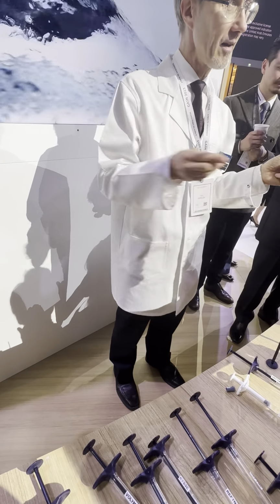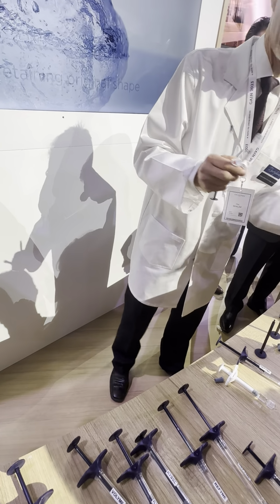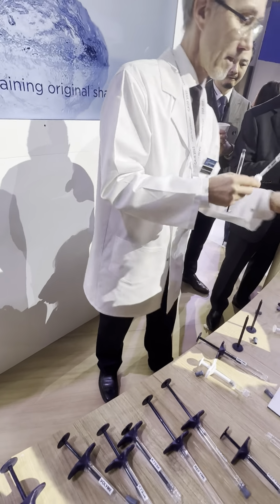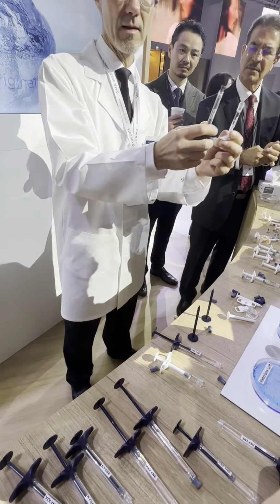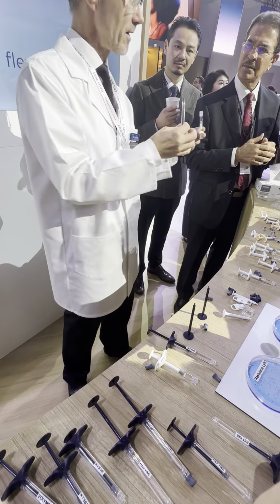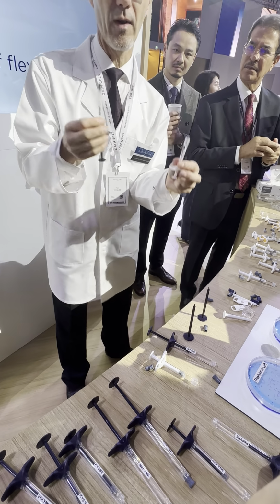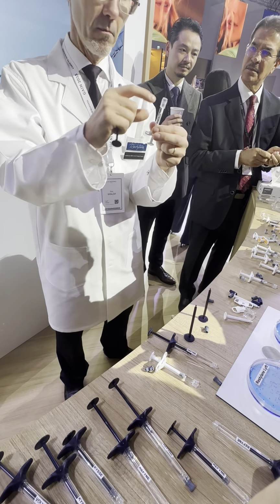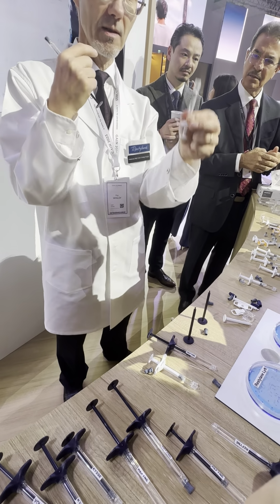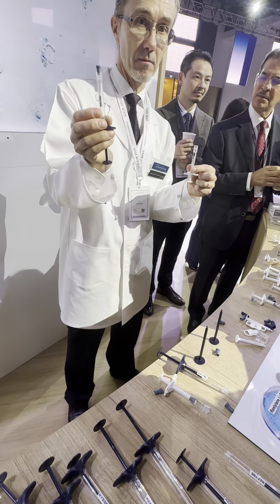This product is actually the same as Restylane Classic. A big difference between these two is the capacity to absorb liquid. This one can absorb maybe 2 times its original volume in water, this one maybe 10 times.